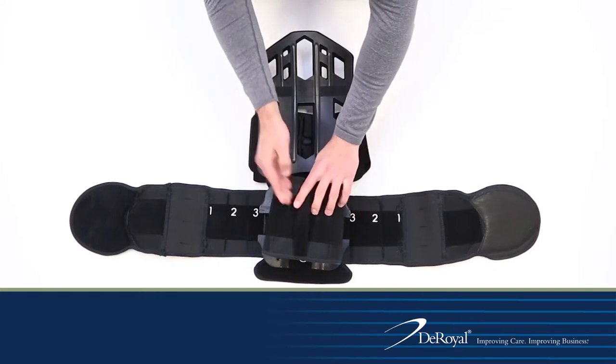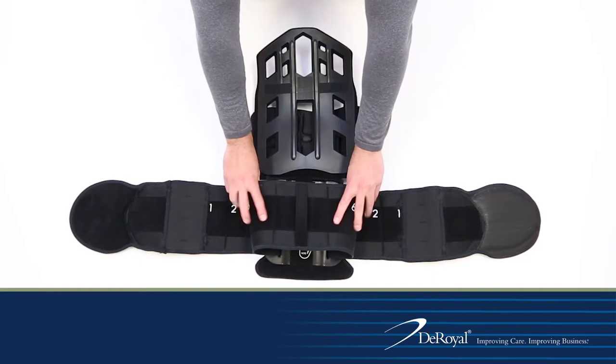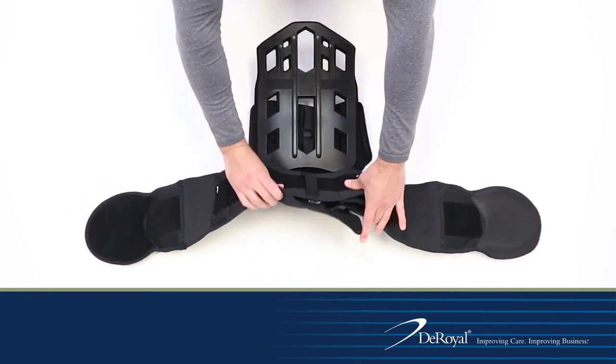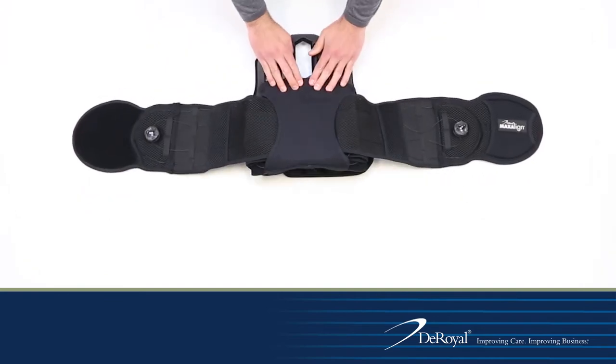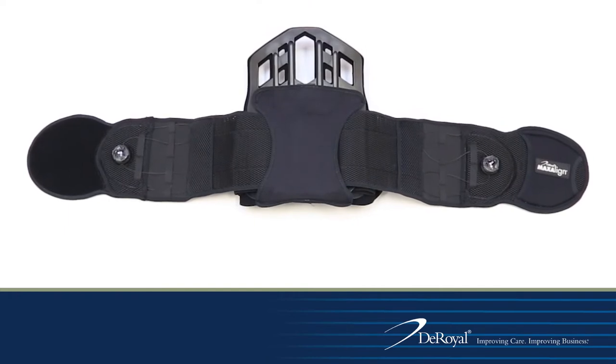Ensure the sizing zones are even on both sides and secure the belt security hook flaps. Fold excess belt fabric down evenly and press down firmly. Flip the back panel and belt over.